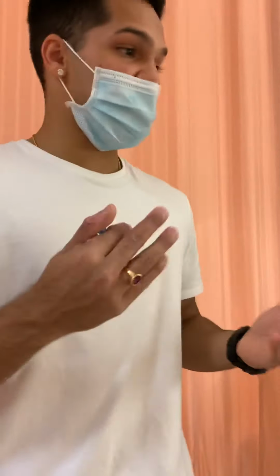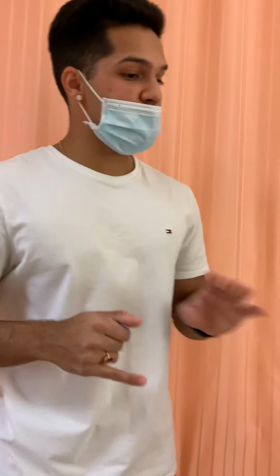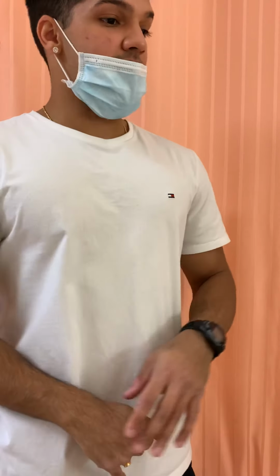I'm going to be asking the patient if he needs anything before I go. Do you need anything before I go? The patient says no. And I'm just going to be assessing everything. Everything is infusing. And now I can do my exit safety check, making sure call bells are in reach, patients aren't distressed, there's no tripping hazards, and bed is in the lowest position possible. And now I can go ahead and leave the room. That concludes my demo.